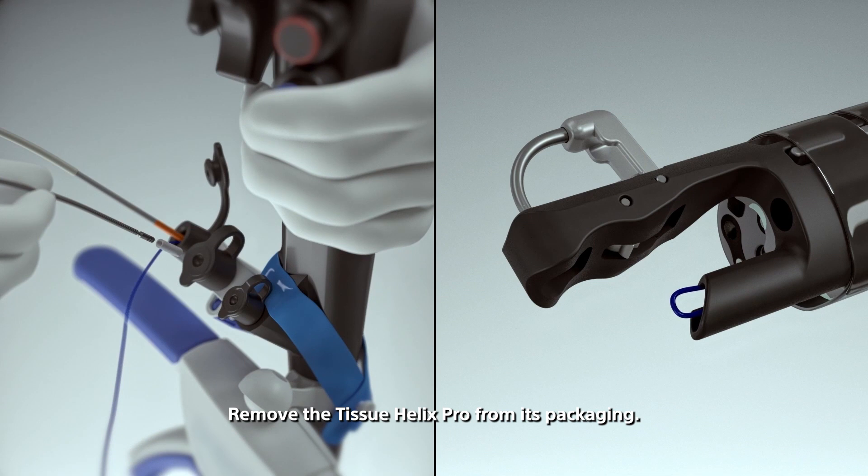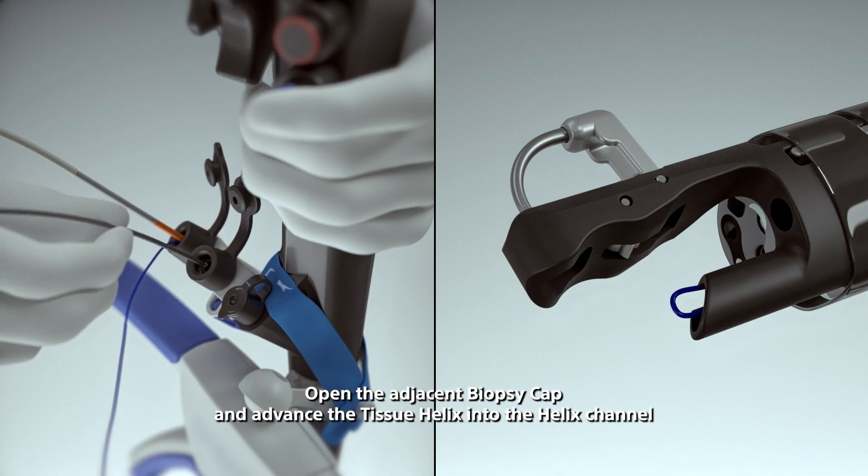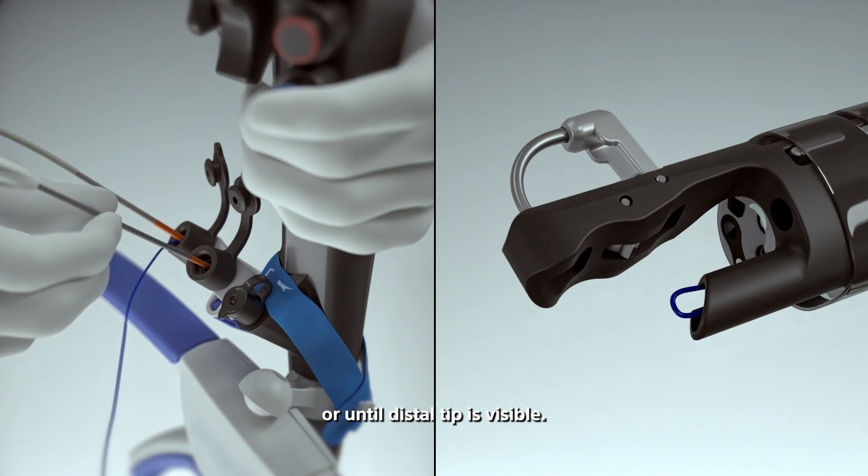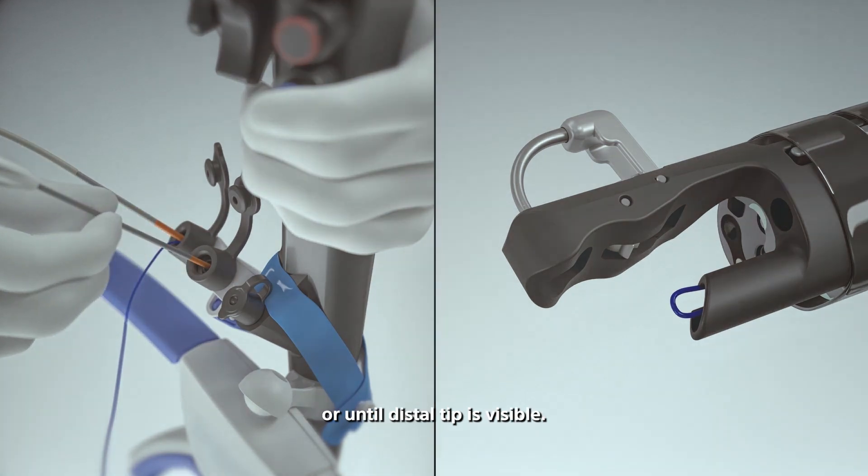Remove the tissue helix pro from its packaging. Open the adjacent biopsy cap and advance the tissue helix into the helix channel until orange depth marker band is at entry of biopsy cap or until distal tip is visible.